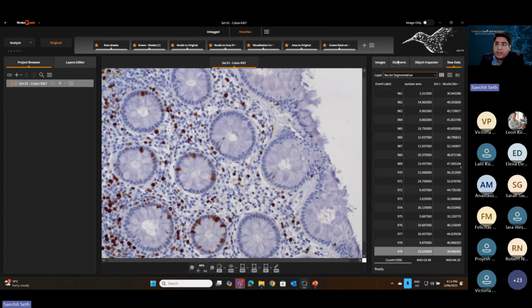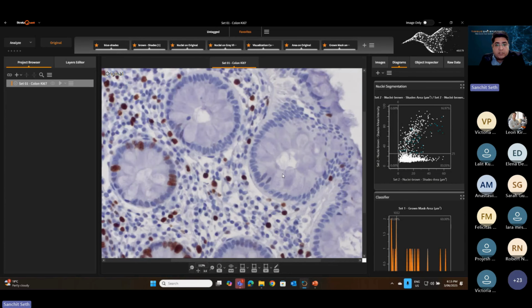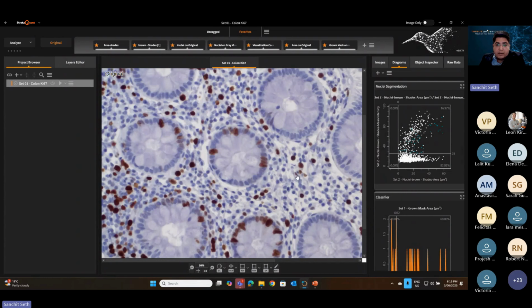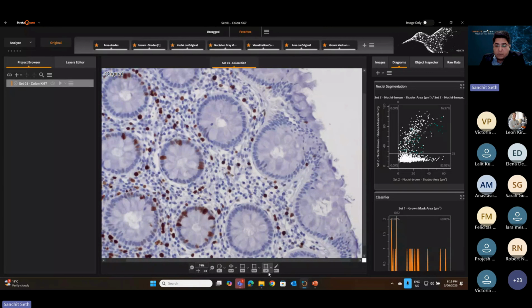In the center, what you see is the image. So when you load the image, your image is presented in here. You can zoom in, zoom out like in Google Earth, zoom in to a single cell level. So you can navigate like in Google Earth in here. There are some really cool tabs or features underneath where you can create your own region of interest. So if you want to create an ROI, you can create an ROI like this, and then you can do the analysis within this ROI, and then this ROI analysis can be linked with the actual sample as well.